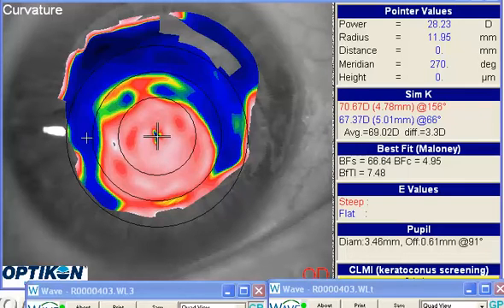One thought is, depending on how small your other lens was, I found in a couple of cases in my own practice that although the semi-scleral was a nice design, I almost found myself staying with a corneal fit, just going to a larger diameter corneal fit. Because when you get up here in the sclera, you get the kind of arcing over here. And I know in your lenses you had quite a bit of fluorescein pooling out here through the outer areas and some bubbles being trapped.